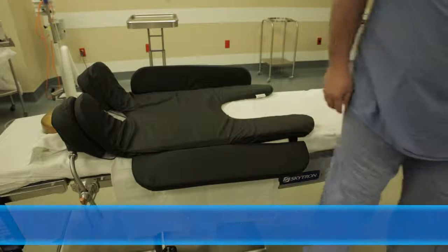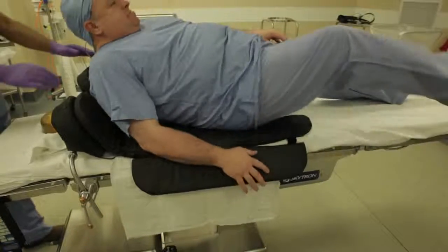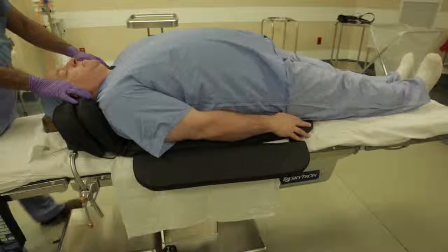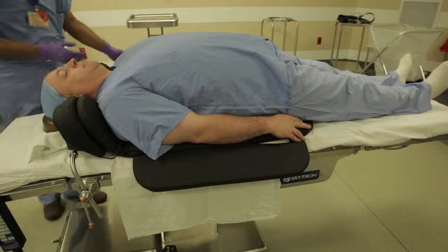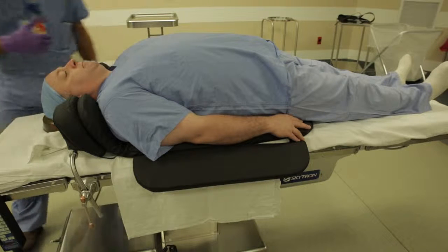While the patient is awake, lay him or her down with their back on the TPS gel pad and their head between the TPS stabilizer wedges, taking care not to put pressure on the shoulders. The shoulders should touch the TPS gel pad, but without adding pressure to the area.